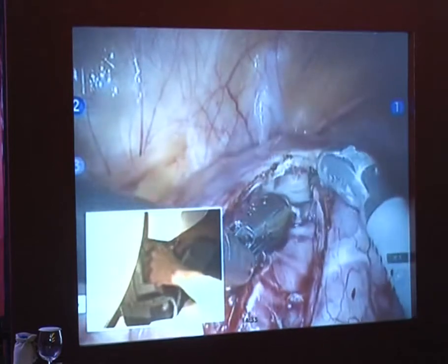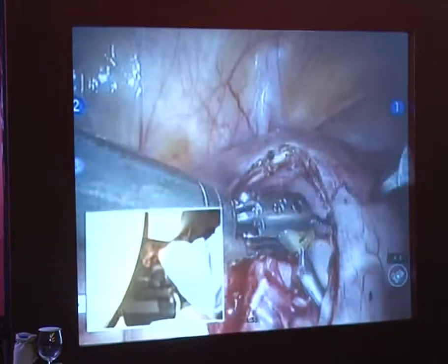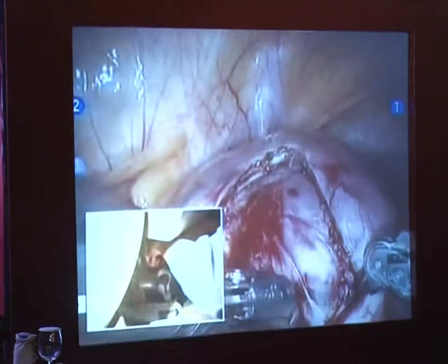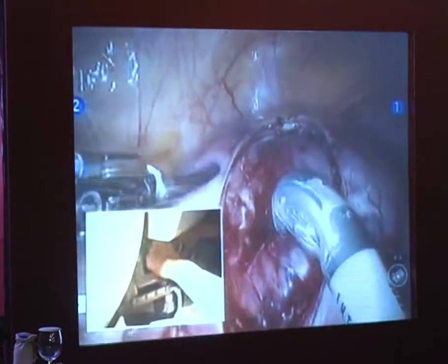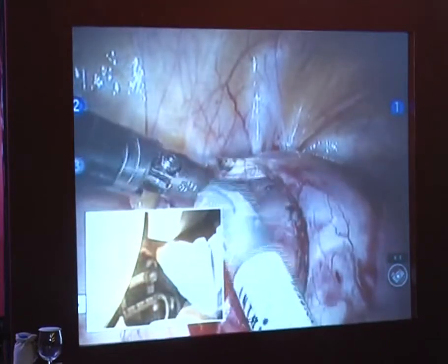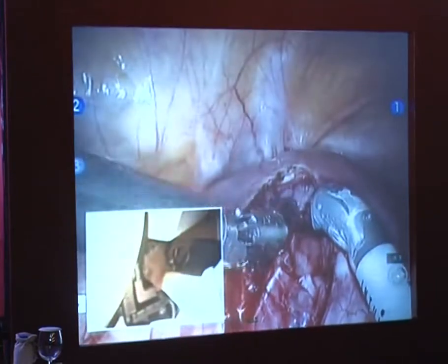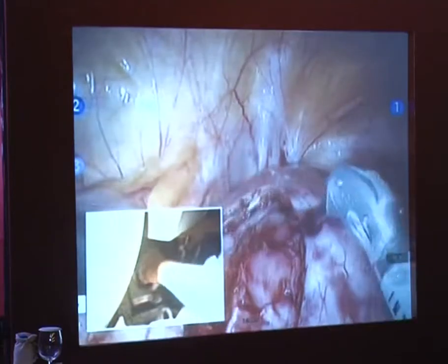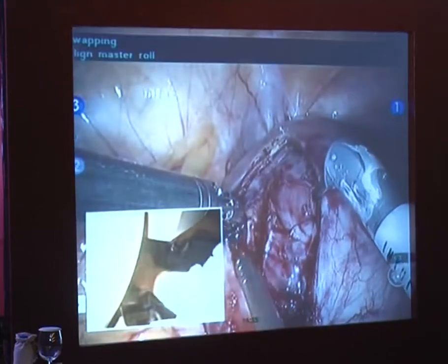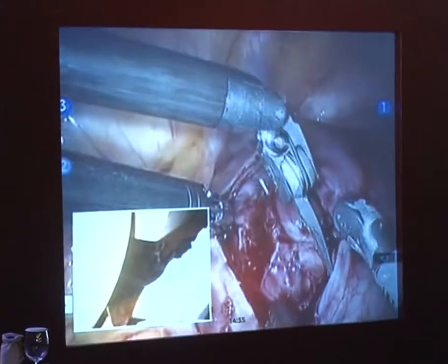Now, one of the more difficult myomectomies to do is actually these slightly anteriorly located ones. And the reason I say that is because you end up with not a lot of room to pull the myoma out, as you can see here. Because we don't have a lot of anterior abdominal wall space to work with, I'm already pretty close to the anterior abdominal wall. So I'm going to continue to try to bivalve this a little bit more. Unfortunately, she's going to end up with a slightly larger incision. Part of my issue here with her, too, is she's so darn little. It's a pleasure to work with somebody little, but at times it actually works against you when you do robotic surgery, because I don't have a lot of abdominal wall real estate to work with here.